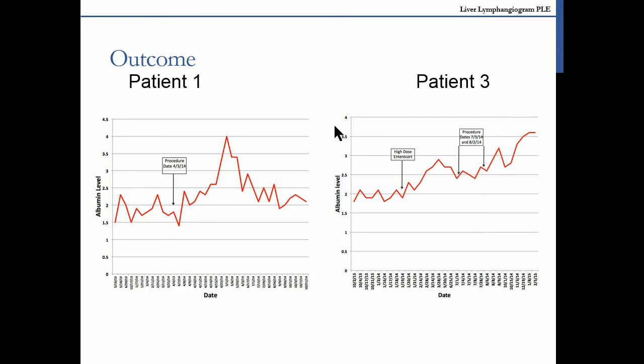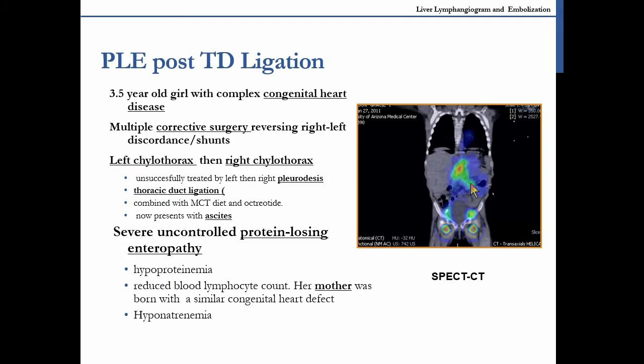Does embolization work? It does work, however temporarily. So this is the first patient we injected with Lipiodol. We thought we were going to embolize with Lipiodol. She improved up to 4 and then slid back. Patient number 2 decided not to wait and got a heart and liver transplant 2 weeks after our procedure. Usually it takes 1 month before the albumin climbs. And patient number 3 improved significantly for 6 months. It's not an updated slide; it's actually sliding down right now after 6 months. So the mechanism is clear there. We don't know yet how to treat it right.